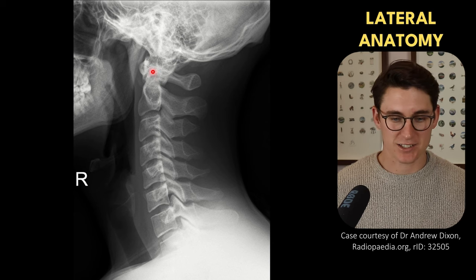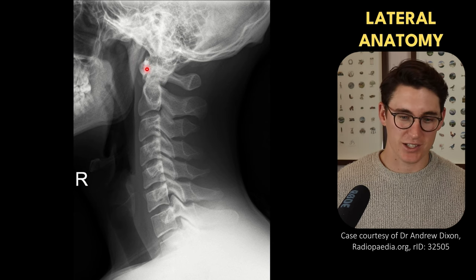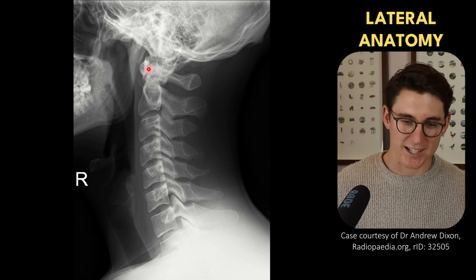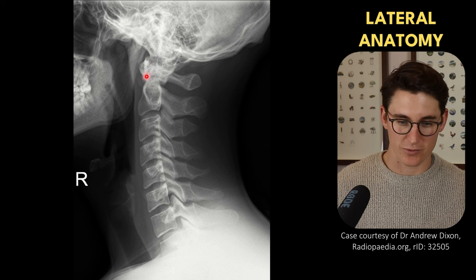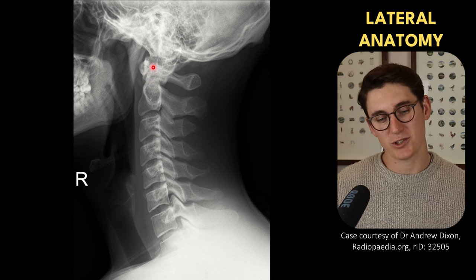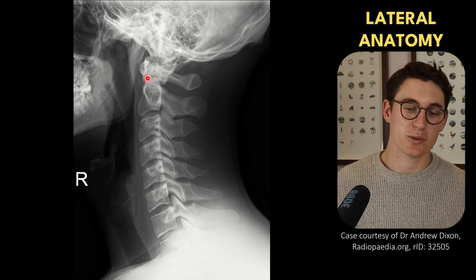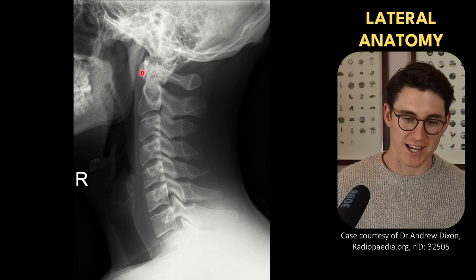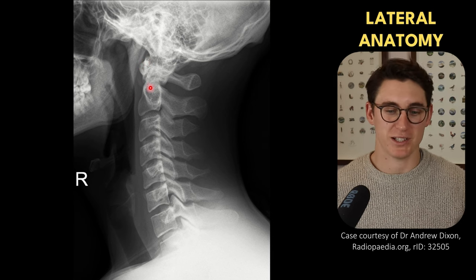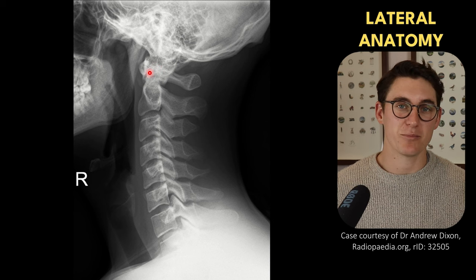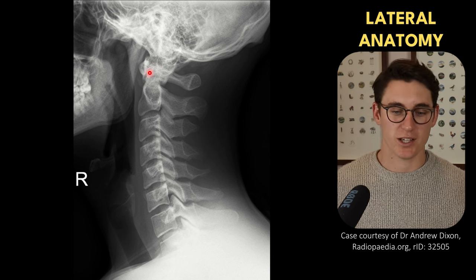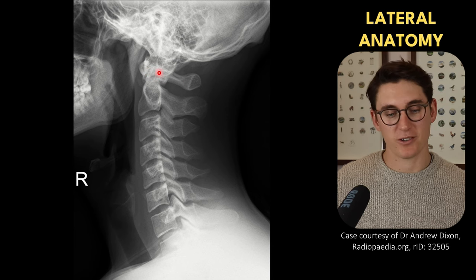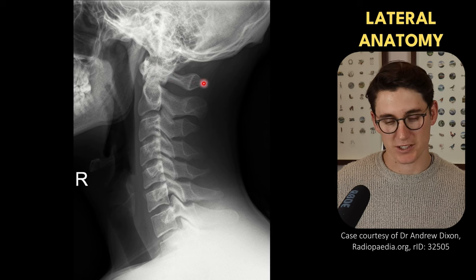Let's look at the anatomy of the cervical spine on the lateral view, starting at C1, our atlas. You can see the anterior body forming almost an oval shape with a flat posterior surface, which articulates with the anterior surface of our dens. Following the outline of the dens, it protrudes into the C1 vertebra. The space between the anterior surface of the odontoid and the posterior articular surface of the anterior body of C1 should be less than 3 millimeters in adults and less than 5 millimeters in children. We can also see the posterior body of C1 and a small spinous process.